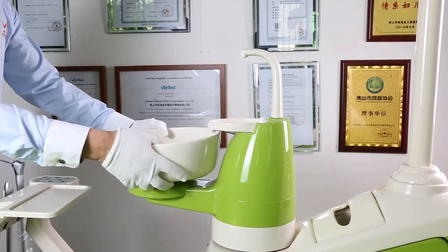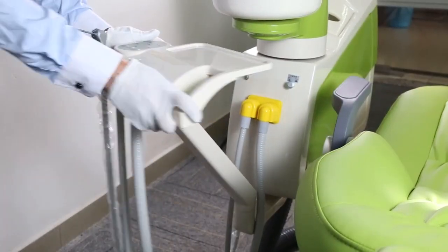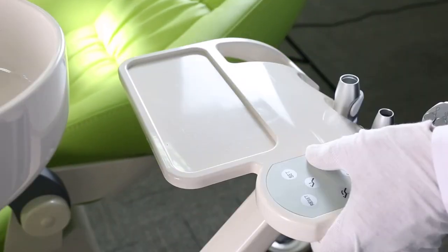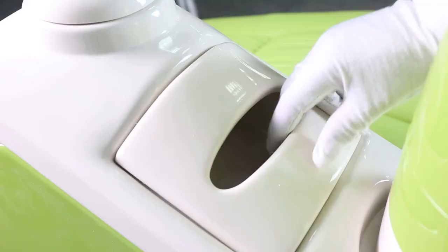The Rotatable Unit Box is easy for maintenance. The Rotatable and Detachable 90-degree Spitten is easy to clean. The Rotatable Assistant Tray is easy for operating. The Suction Filter is easy to take out and clean.